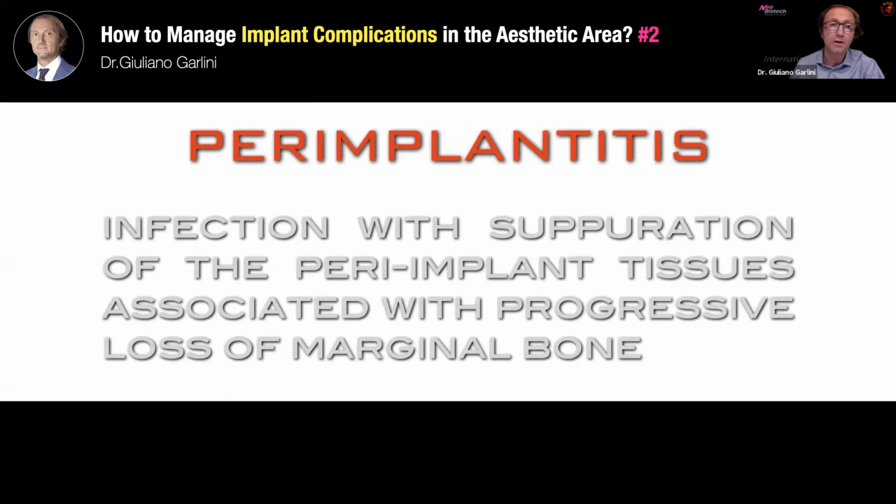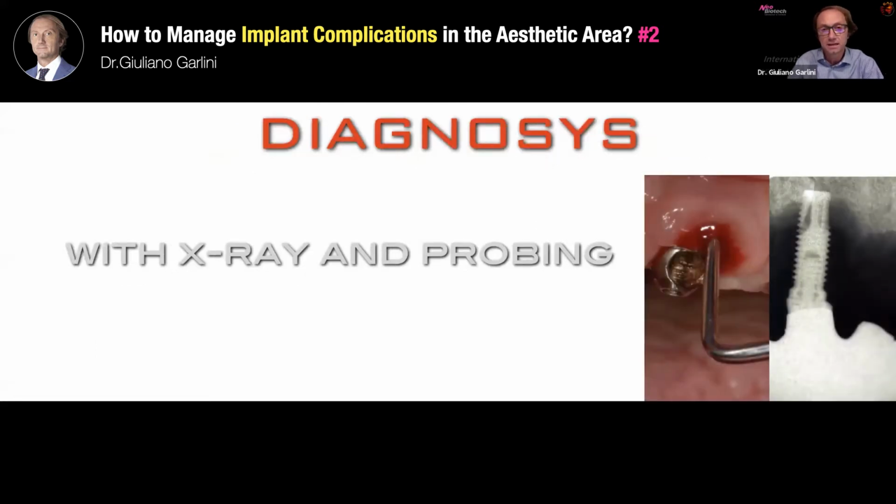So it is very important to understand if we are in front of a mucositis or a peri-implantitis, and how we can make the correct diagnosis. Only with an X-ray and the probing around the implant. So the correct diagnosis is made by X-ray and by the clinical visit, the clinical approach to the patient.